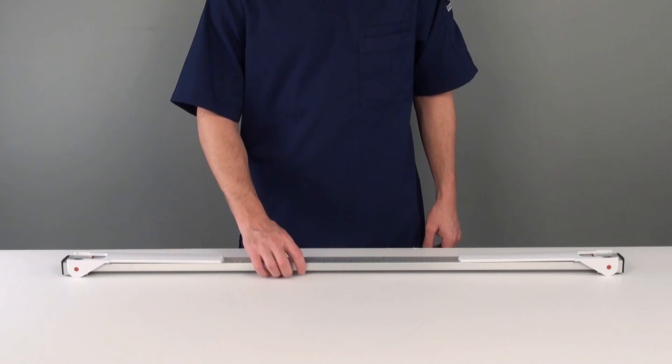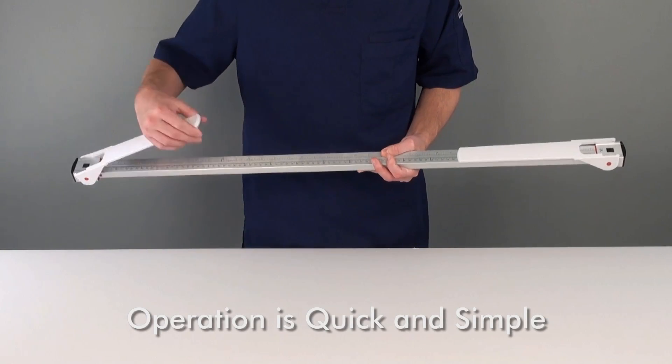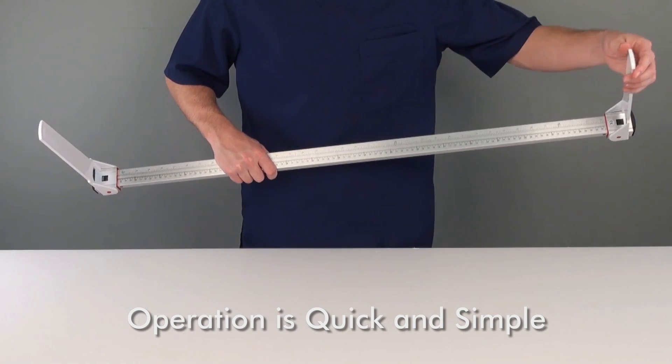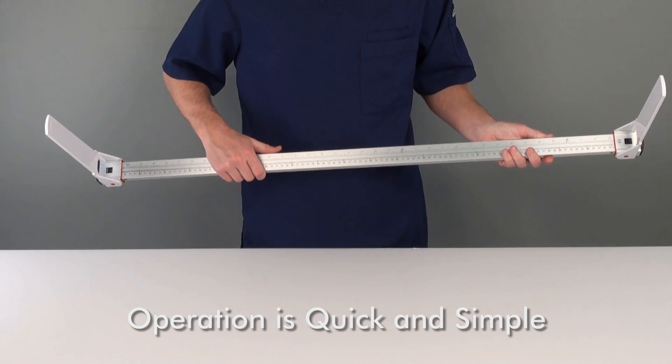Operating the MLM Infant Stadiometer is extremely quick and simple. First, place the infant on a stable, flat surface with adequate room for measurement.